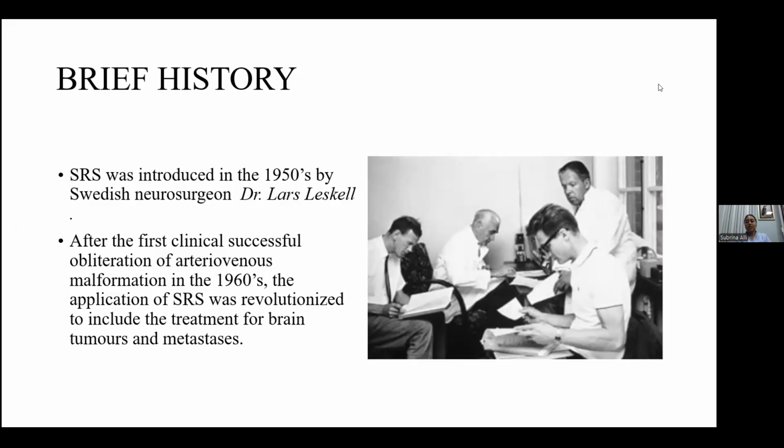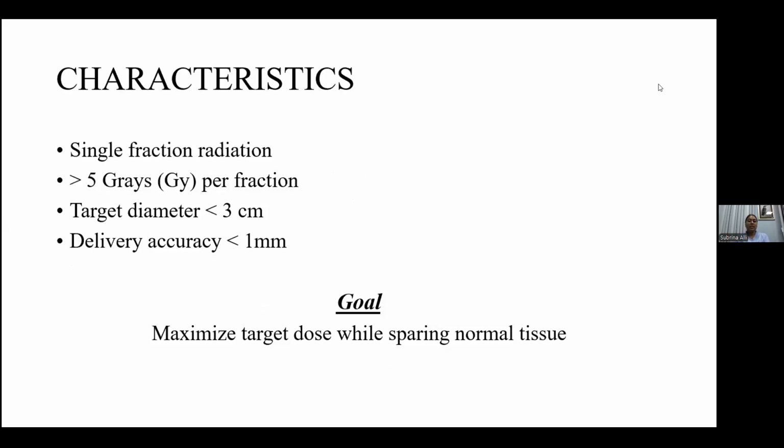In this study, he followed up these patients for a 6-month period after the application of stereotactic radiosurgery, and they realized that there was actually no patient mortality and very little patient morbidity, in terms of the length of the hospital stay or the complications that would happen after the typical treatment, which is craniotomies. So what are the characteristics of stereotactic radiosurgery?